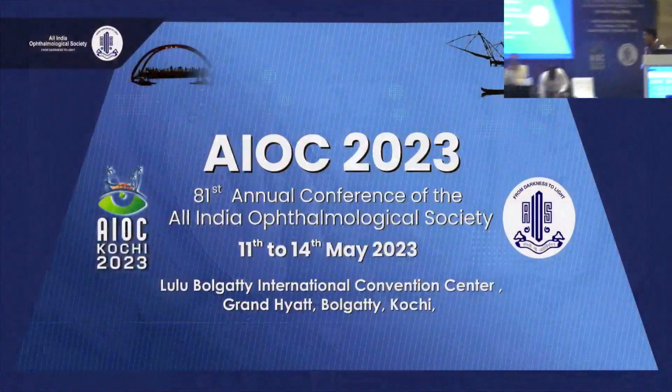Thank you, Dr. Satanshu, for the beautiful videos and very beautiful techniques you have shown on how to explant these IOLs. A very simple query: when you are explanting the opacified IOL, or the hydrophilic IOL or hydrophobic IOL, what difference do you find? He is also an expert in this, removing the fluid. So Deepak will answer this.